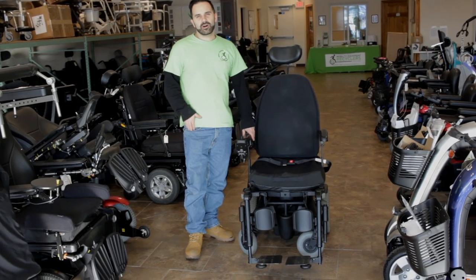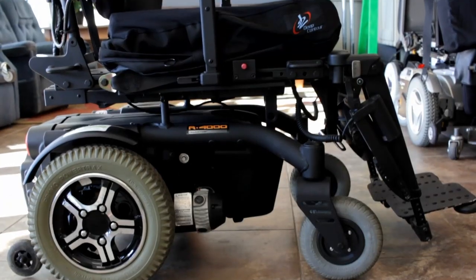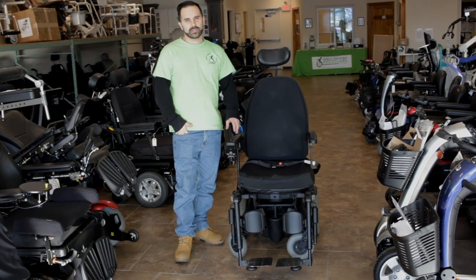In addition to the off-road capabilities of this chair, it's also good for rehab capability as well. It has some power seating functions like tilt, recline, and also power leg rests.